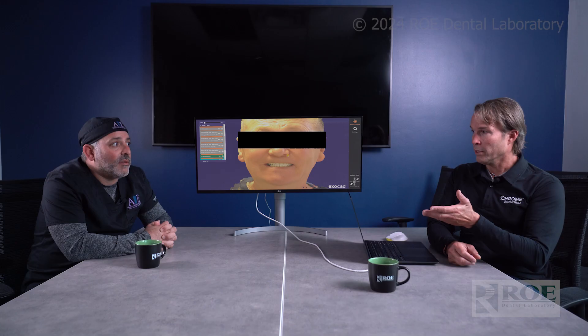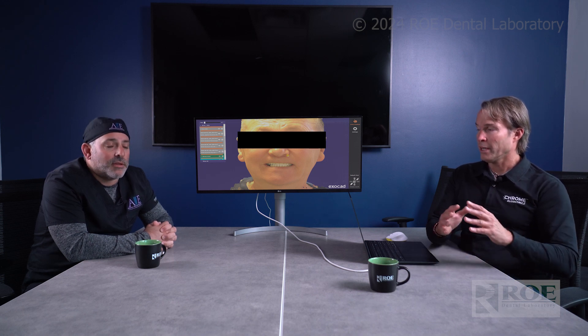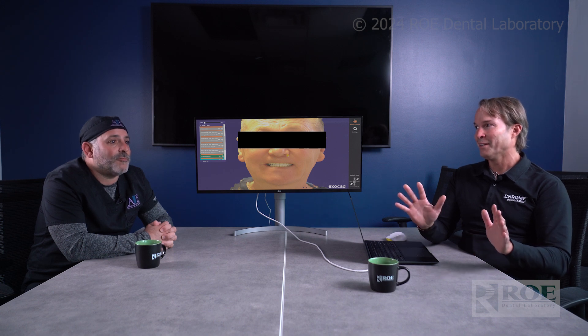Here's the exciting part: we're going to take a patient in double arch zirconia restorations, make new upper and lower, and lower the entire plane of occlusion four millimeters — all from facial scans, to make sure the teeth match the face. On the maxillary side, we also used photogrammetry records, which at that time was all we had to make these records accurate and fast for a quicker turnaround. We first made him a full arch final zirconia to go against the lower existing hybrid — using iCam 4D — but then he wanted something more youthful.